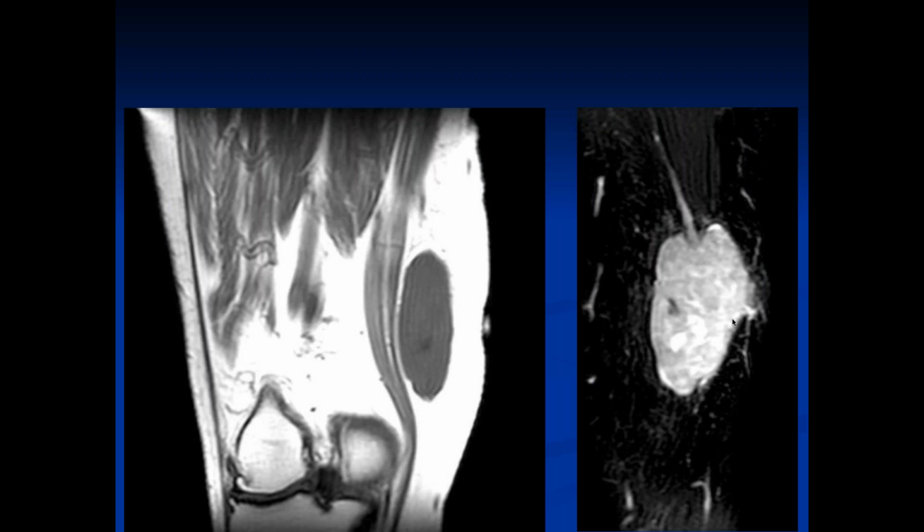So it looks like a coronal and maybe a sagittal image of the patient's thigh and knee. Post, okay, and then T1 pre without fat sat. You know, I don't want to necessarily call this, okay, well, yeah. So on the post, there is this kind of heterogeneous enhancement, well, presumed enhancement. I don't want to really commit myself without a fat-sat pre, but it sure seems to be enhancing.